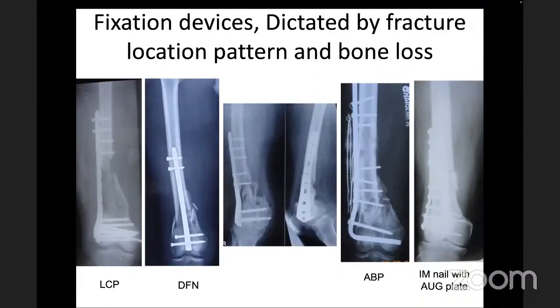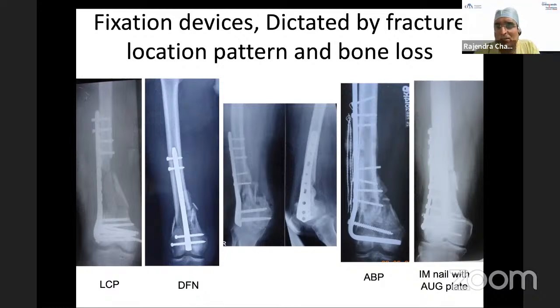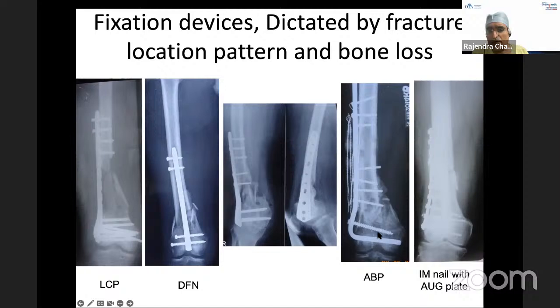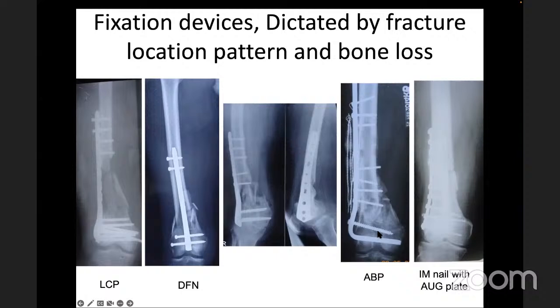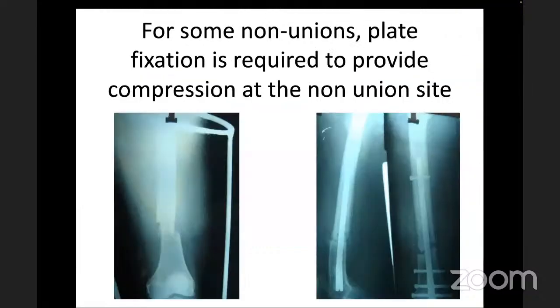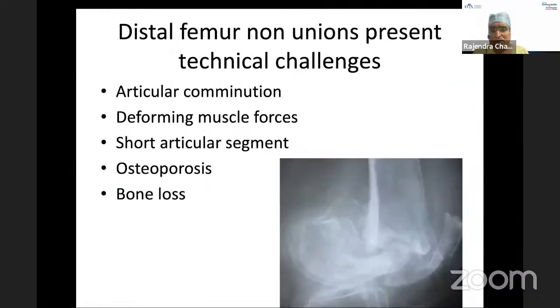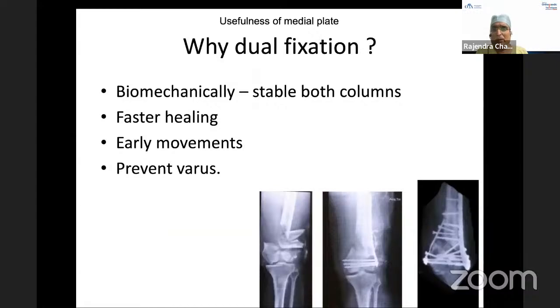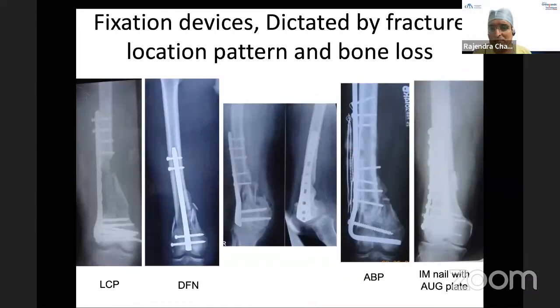Sir, sorry to interrupt you. Please, go ahead. For putting an angle blade plate, you need to have a good distal segment, so that you are able to put a blade and the screw above. This much minimum is what we need. Otherwise, with very low distal femur ends, this may not be an efficient implant, sir. That's the only thing I wanted to add. For this patient, I was not able to consider that because there was no bone stock where an angle blade plate would give stability and there was nothing to hold. So I think a minimum of 3 to 5 centimeters is what we need for an angle blade plate. Yeah, this is where we were.